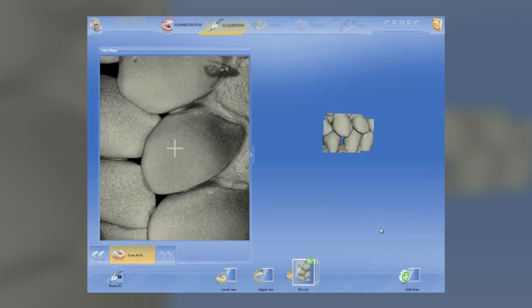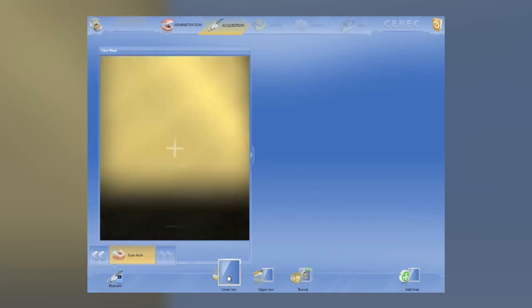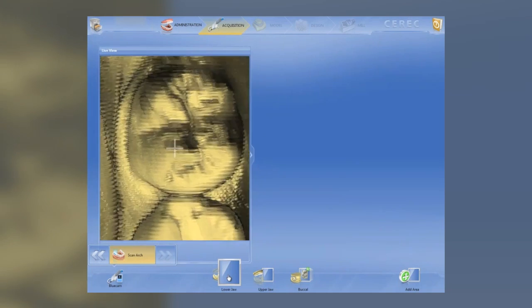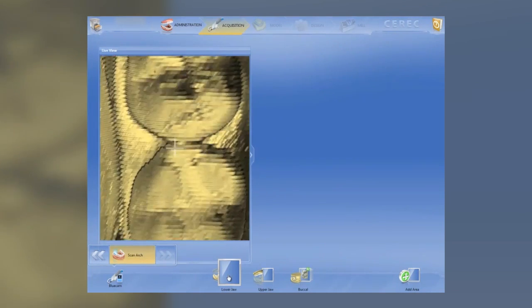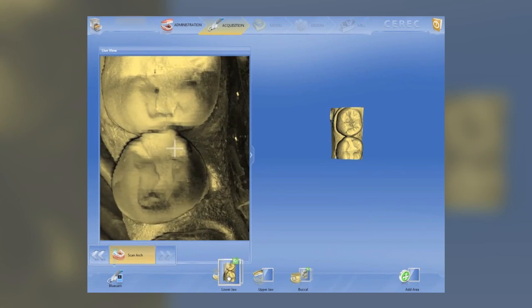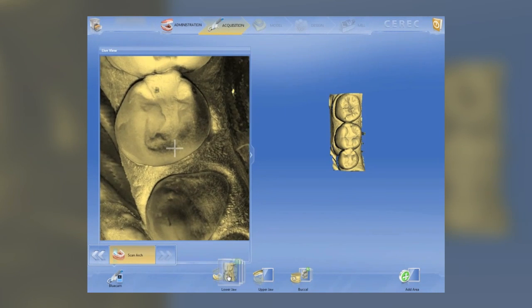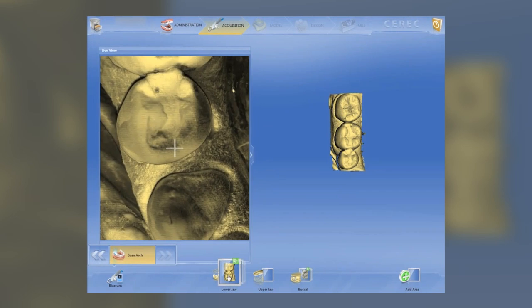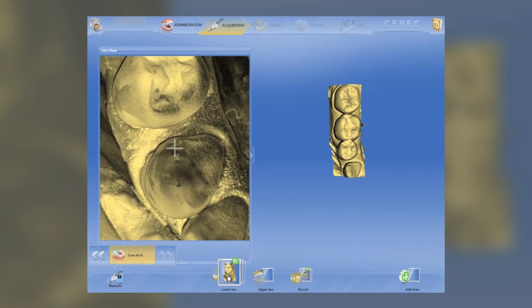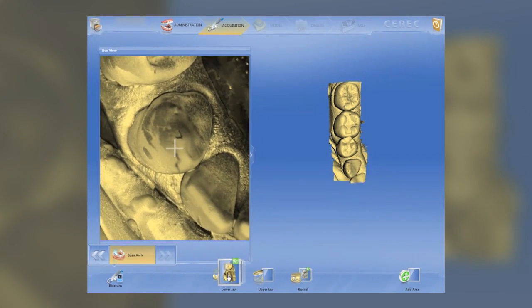As you notice, the image libraries are called lower jaw, upper jaw, and buccal bite. There's another field you could add if you wanted to bring in more information. We'll capture the opposing arch. As we get closer to the canine and premolar area that we captured in the buccal bite, I'm going to go ahead and grab some roll shots to the facial to capture information below the height of contour. This will aid tremendously with getting the images to stitch through the buccal bite.